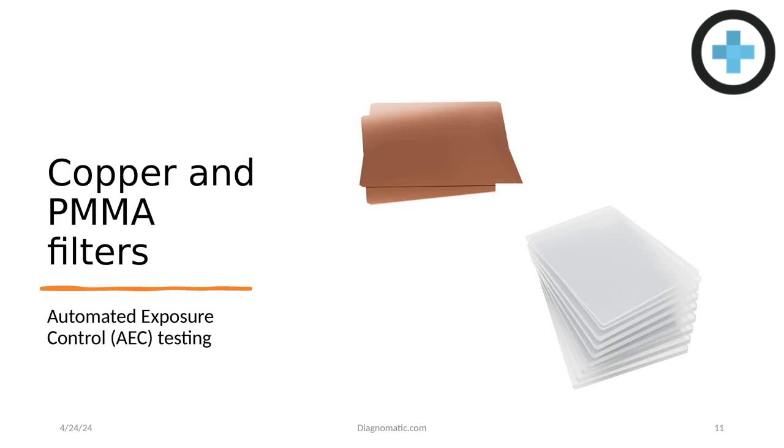So here we have a pair of different filters, first being copper filters. Copper filters have a relatively high atomic number, which means that it effectively attenuates X-rays. These automated exposure control systems rely on detecting the amount of radiation that passes through the patient to adjust exposure parameters. And these copper filters provide a known, measurable level of attenuation, which allows technicians to verify that the AEC system is correctly responding to changes in X-ray intensity.